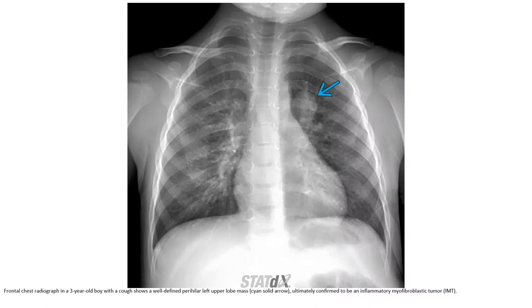From the chest radiograph: a 3-year-old boy with a cough shows a well-defined, slightly hyperopaque left apical mass, ultimately confirmed to be an inflammatory myofibroblastic tumor.